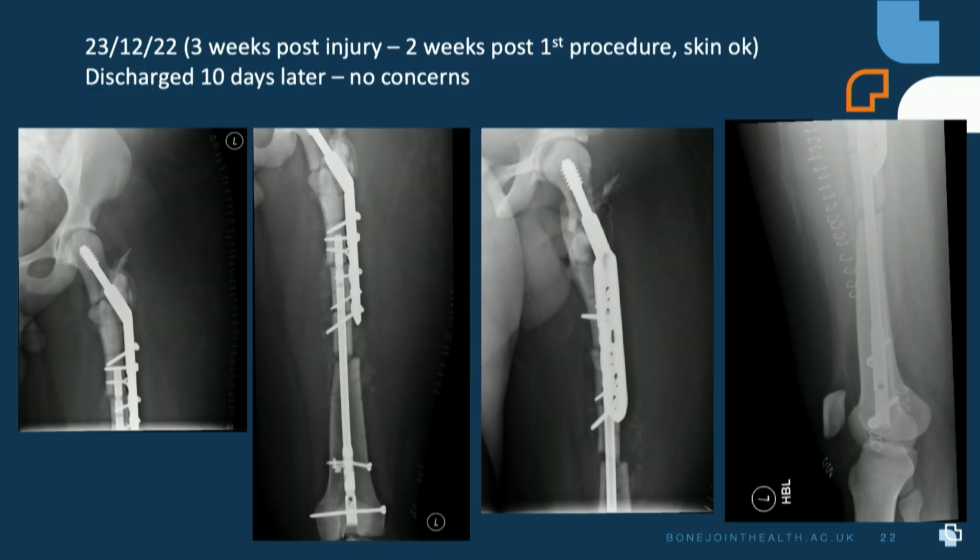So we went in and did this. We valgized the neck, filled that with CERAMENT G. We took samples by the book, 5 for microbiology and 2 for histology. Retrograde humeral nail, just to be sure that it would fit, because of smaller size. We caused 2 more intraoperative fractures through the previous plate holes, being very careful, still we did that. And we broke a few drill bits trying to lock the nail. Anyway, 10 days later, he went home.